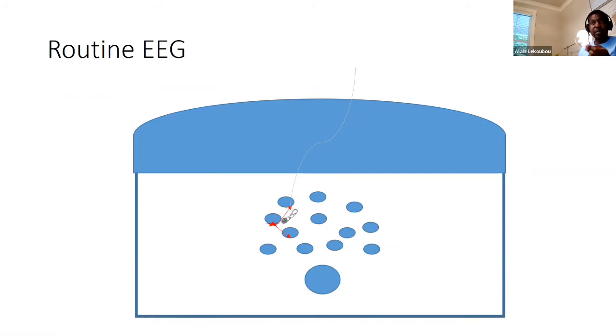You want to know exactly where it is coming from, then you get your microphone and sneak it into the room, and you get close to where things are starting. And then you know exactly that they are starting here. And you can tell your surgeon to go and remove exactly that area of the brain or burn it. It's precision. Okay. But how do we do that in practice?